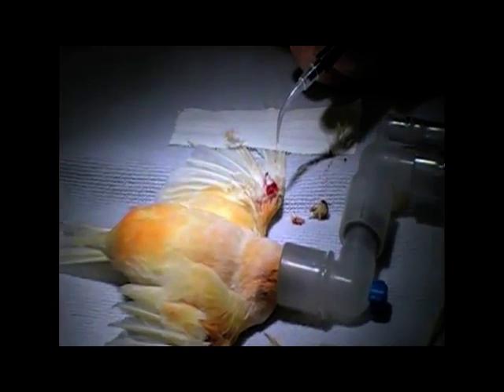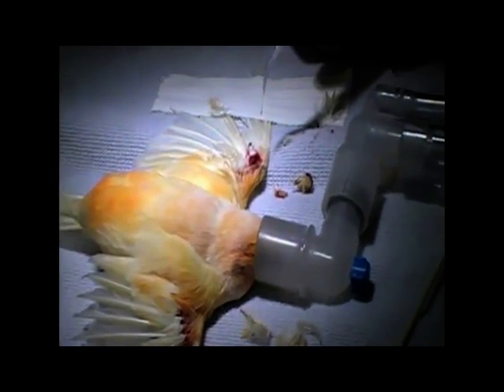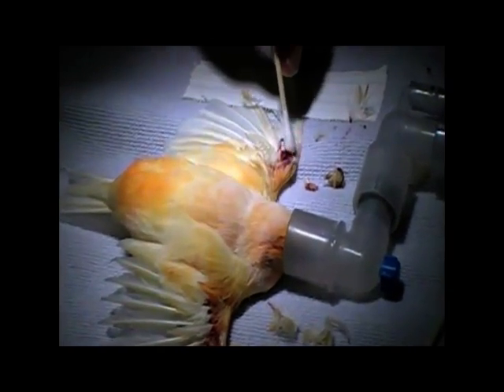Now I've got that closed up and I'll treat it with some biostimulation. I'll back up a little bit further. The laser is on a continuous mode. So that side is done and I'll let that be.